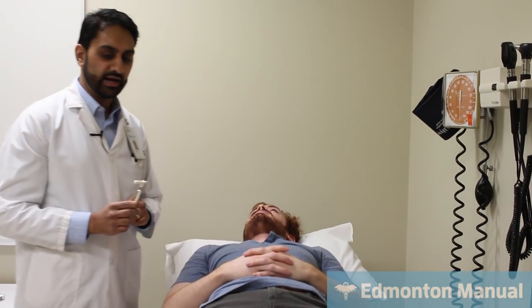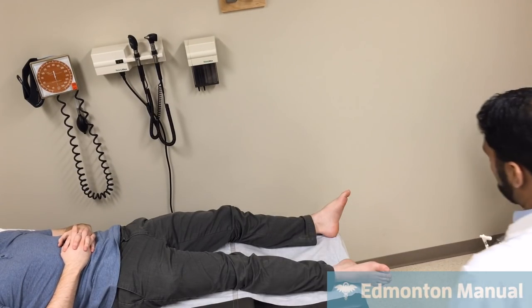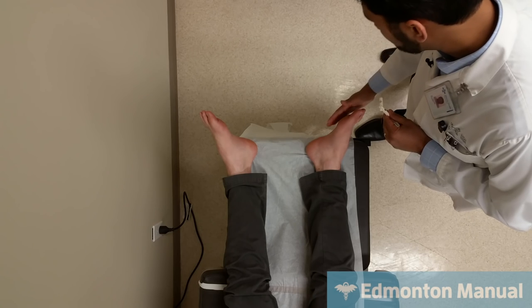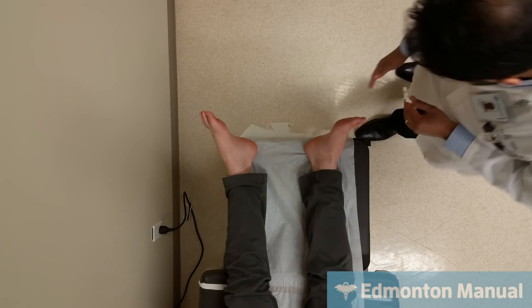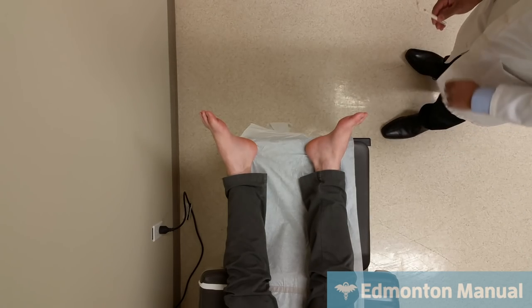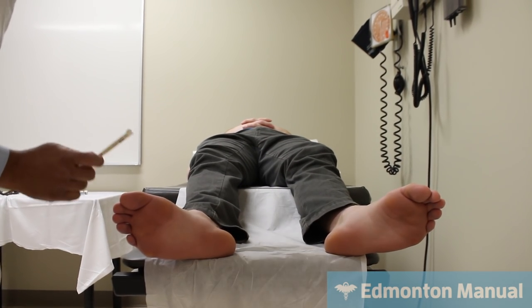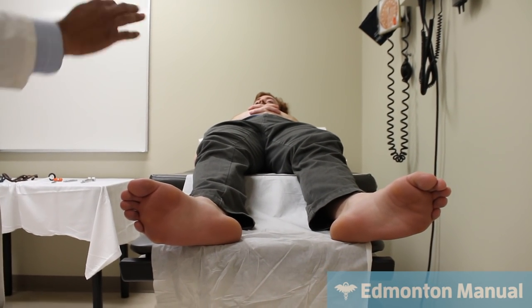So what I'm going to do now is move down to the feet, and what we will generally do is, depending on older, newer guidelines, older guidelines used to talk about 9 areas on the plantar aspect of the foot, and usually 1 area on the dorsum. The previous 9 areas were often 3 toes. And sorry, please say yes every time you feel me touch, and let me know if it feels the same as your sternum or if it's reduced.